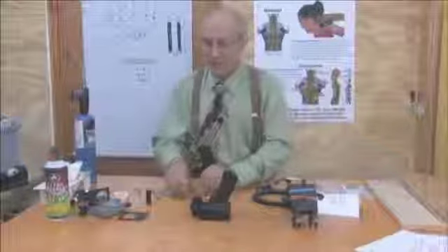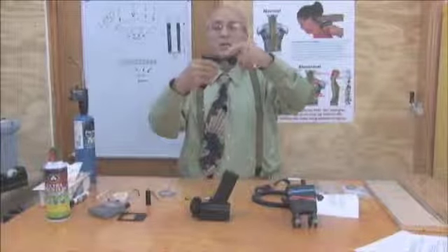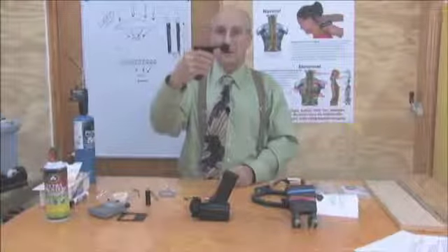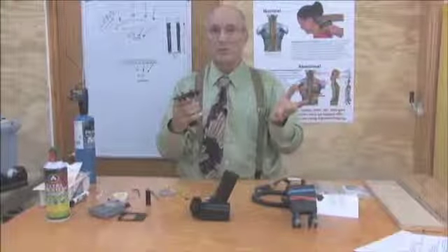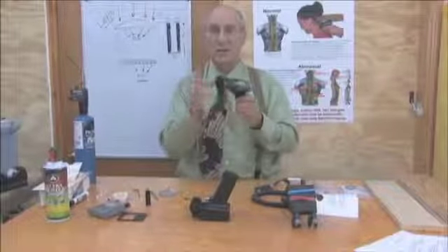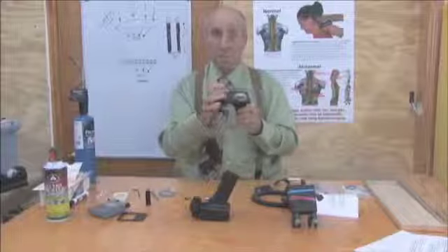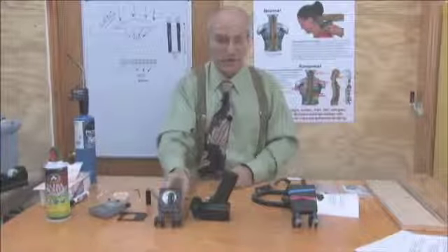The C5000 and C6000 scanners have very strong machined aluminum struts that hold the wheels. Ever since we've been building the C5s and C6s, I have never seen a wheel assembly bent or broken in one of those series of Tytrons.